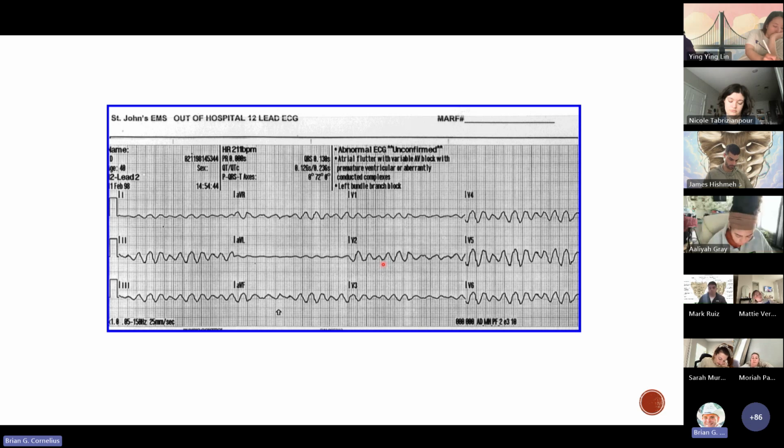Now, how common is this? Some people walk around with bifascicular blocks every day, and they're doing fine with it. But if you have a patient that's clinically symptomatic with a bifascicular block, be very concerned that they're at high risk for cardiac arrest. This is somebody I would go ahead and consider putting the defibrillation pads on before I take them back for whatever case they're having.